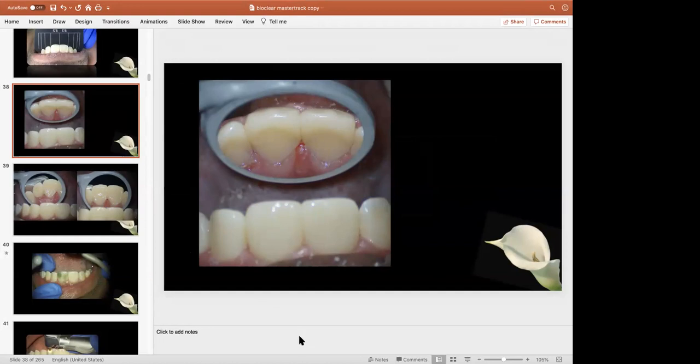Now, if I'm doing a peg lateral, we don't have to do the separate curing of the adhesive step. We go straight to injection molding. So injection molding is 1, 2, 3. Adhesive as a surfactant, air thin but not light cure, then flowable, then paste. So the question is always, do we have freshly cut dentin tubules, which we're going to have a lot of the time. So that's when we have the step where we cure the adhesive. So does that make sense?